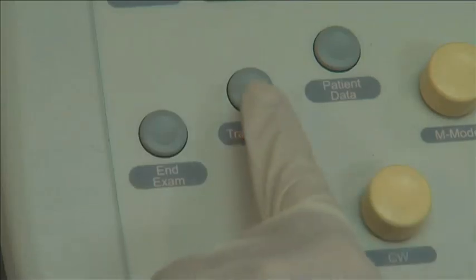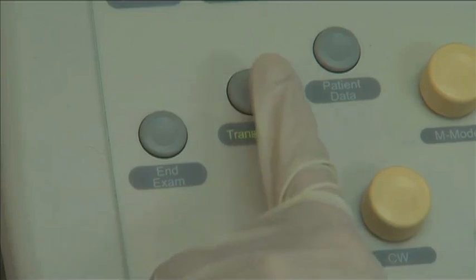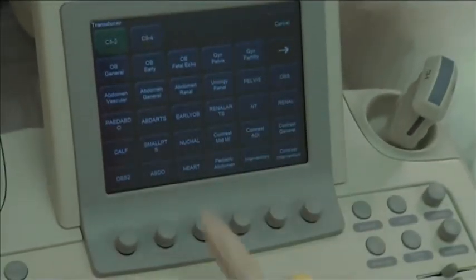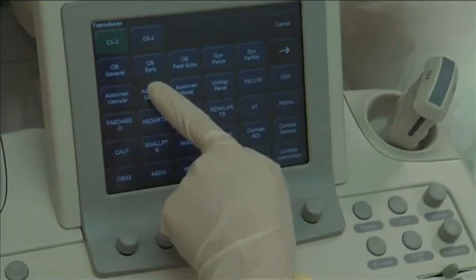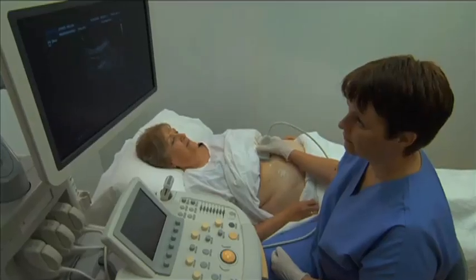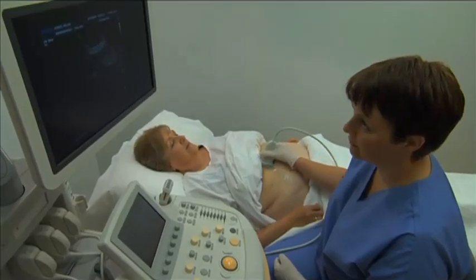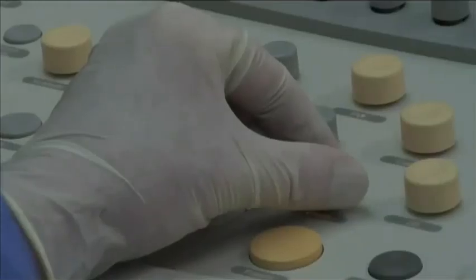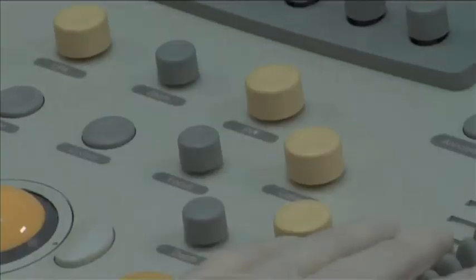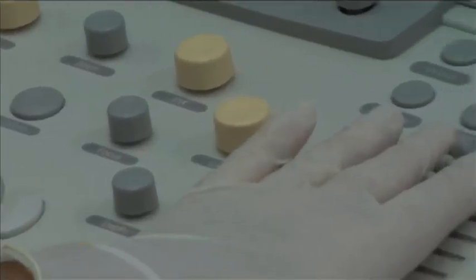Select a transducer of an appropriate frequency. Confirm the correct transducer selection and preset on the ultrasound machine. Perform a survey of the abdomen and make any necessary adjustments to the machine settings to maximize the image quality.